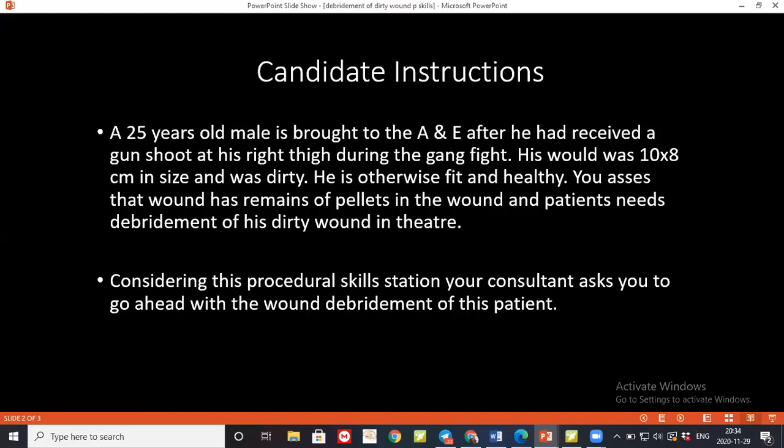Whenever I'm done, as it is a dirty wound, I'll take a gauze — it may be an alginate-soaked gauze or paraffin-soaked gauze — and place it there. I'll give only a small suture if it is allowed, or otherwise according to the size: if it is small we can keep it open. For this patient I would prefer a single dose of antibiotic at induction.